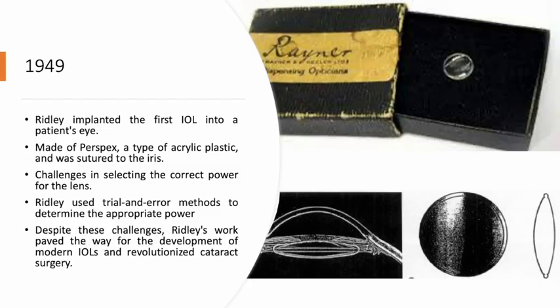While the surgery was successful, there were challenges in selecting the correct power for the lens. Ridley used trial and error methods to determine the appropriate power, which resulted in some patients experiencing postoperative refractive errors. Despite these challenges, Ridley's work paved the way for the development of modern IOLs and revolutionized cataract surgery.